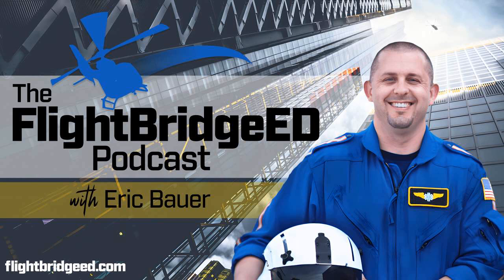So where do we start on our tidal volume? Well, we start at 4 to 6 cc's per kilogram based on ideal body weight. I always tend to start at 6 cc's per kilogram. It's a good starting point. It doesn't give you very high tidal volumes. For the purposes of this lecture, we'll use an 80 kilogram patient through all this math. So if we started at 6 cc's per kilogram of ideal body weight, your starting tidal volume is going to be 480 milliliters.